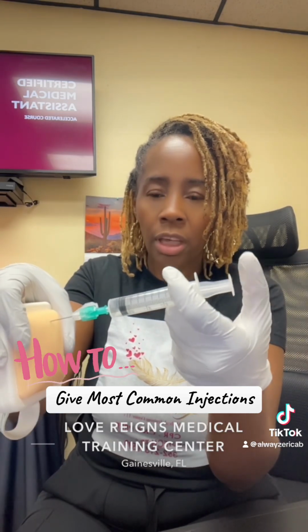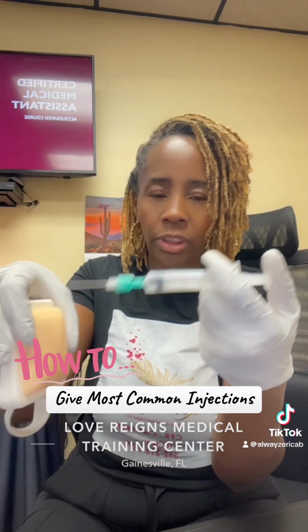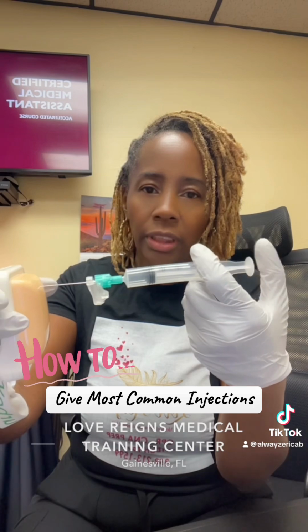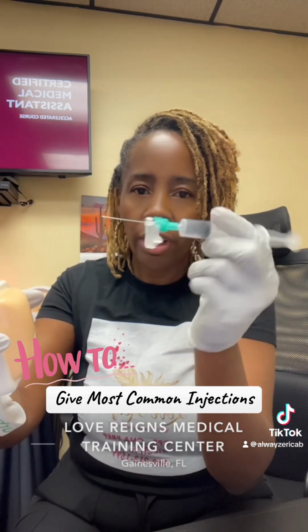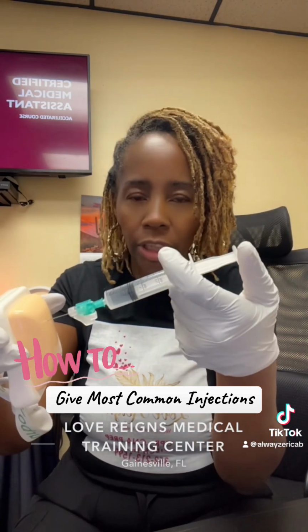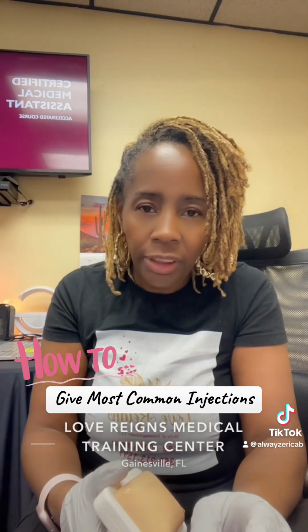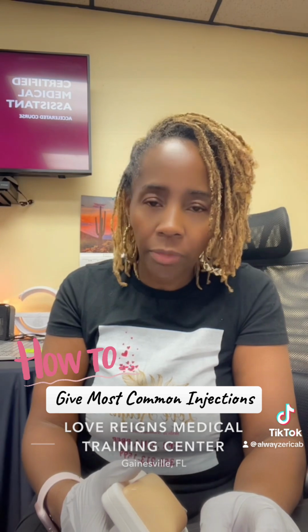They want to do this. And what's going to happen is they're going to push this, and this medicine's going to get shot. So again, you never want to start your injection off with this like this. You need to do it like a dart. Straight in, then plunge. Don't forget, because you're going to accidentally shoot that medicine out, and some of those meds that we've drawn up could be thousands of dollars of medication.